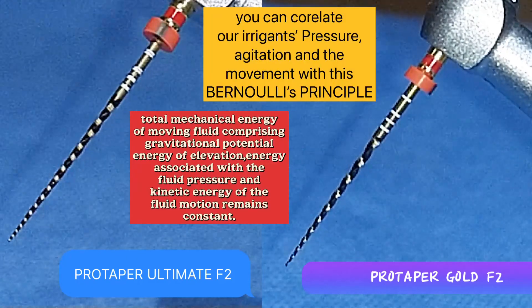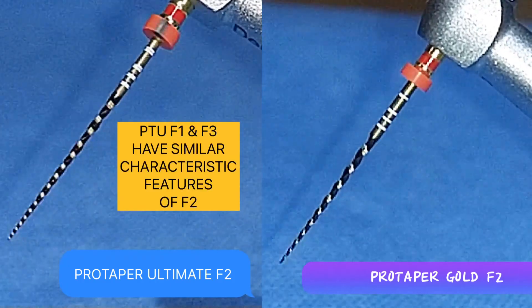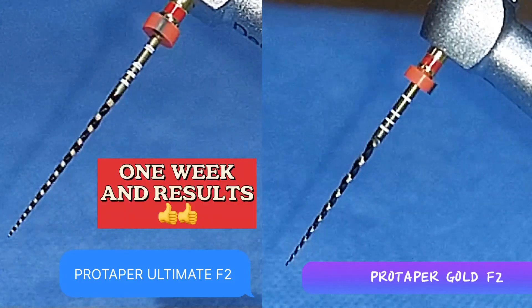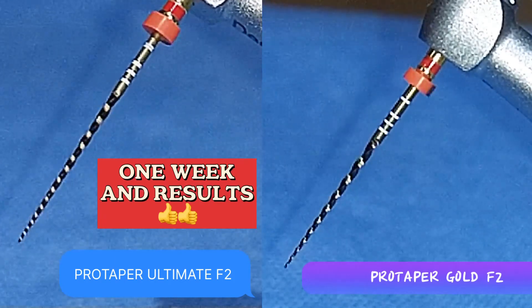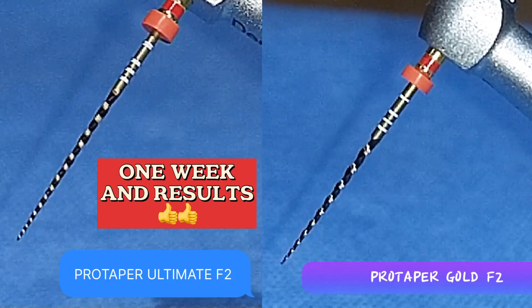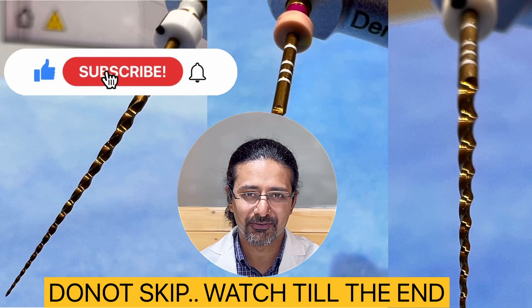This is how these files look in a side-by-side comparison. Coming to Pro Taper Ultimate F1 and F3, they bear similar characteristics to Pro Taper Ultimate F2. I have been using these files on patients for the past one week and the results are amazing. Stay tuned — once they are officially launched in India, I will definitely post my full reviews.